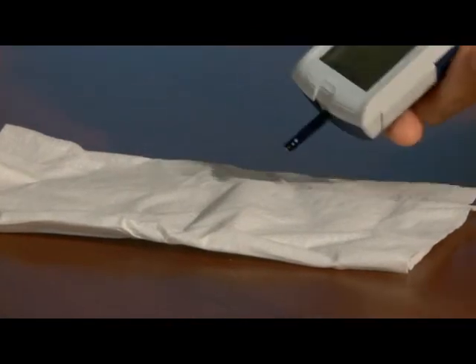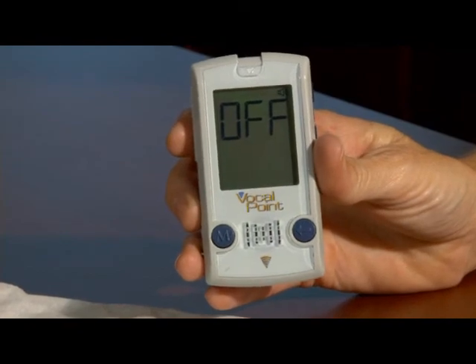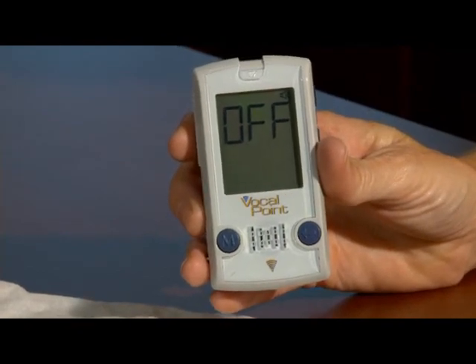Now, eject the used test strip by utilizing the strip ejection button on the left side of the meter to dispose of the used strip. This will turn off the meter as well.